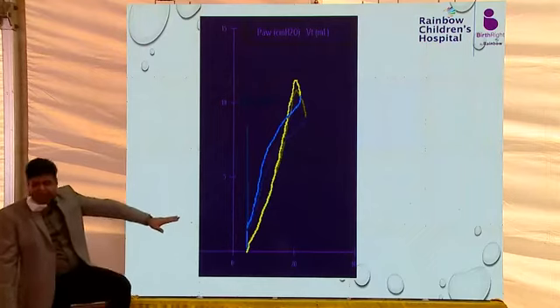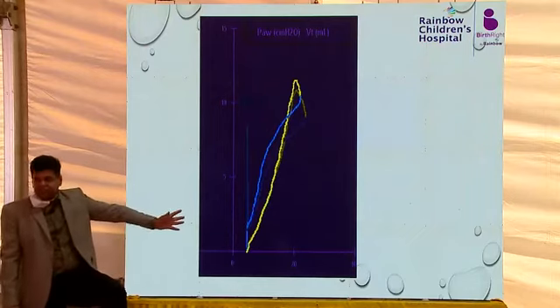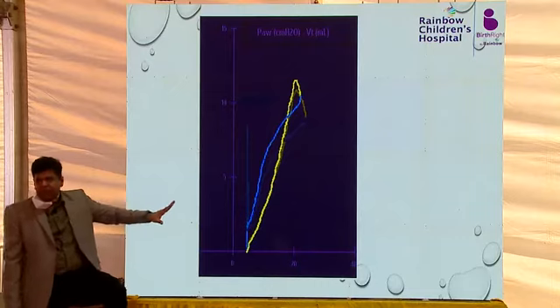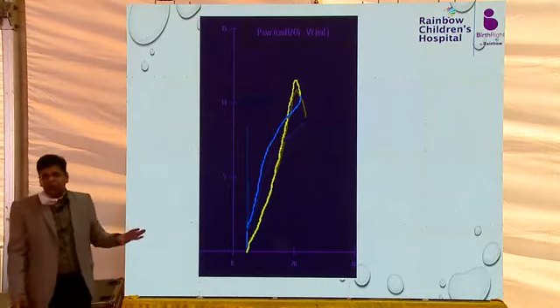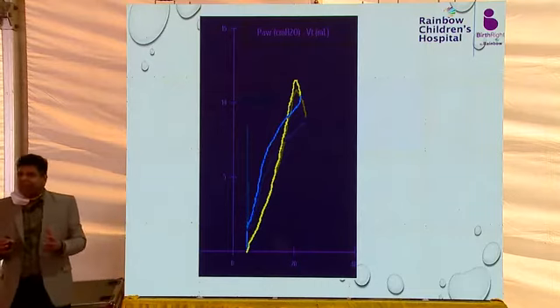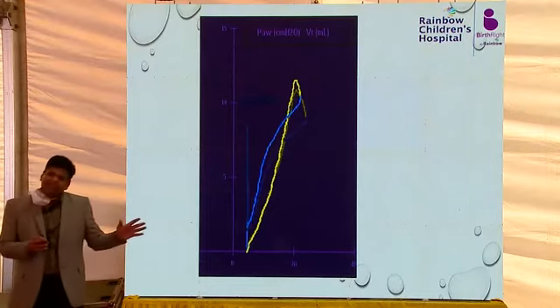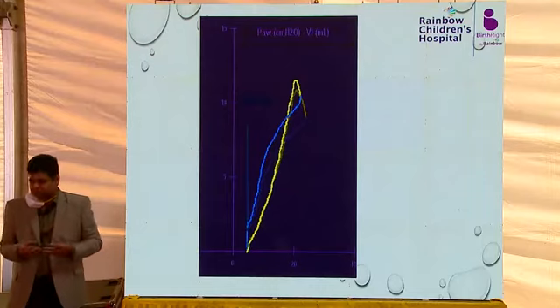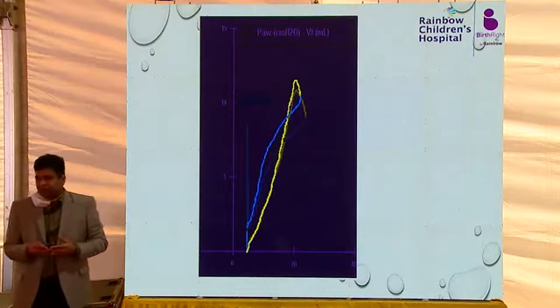Then this happens in flow starvation. The child is breathing at very fast rates, your flow is inadequate. This is called the figure of 8 and you need to increase the flow. In ventilators where you cannot adjust the flows, this rarely happens. This happens when the child is fighting too much or breathing too fast.